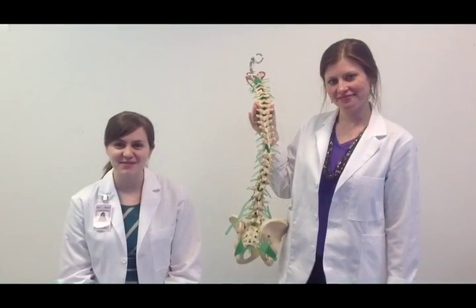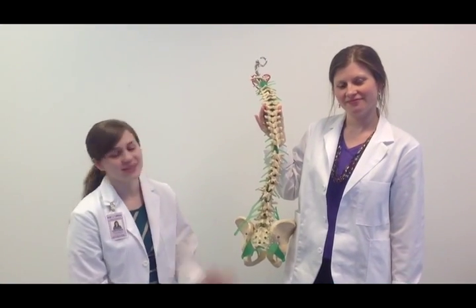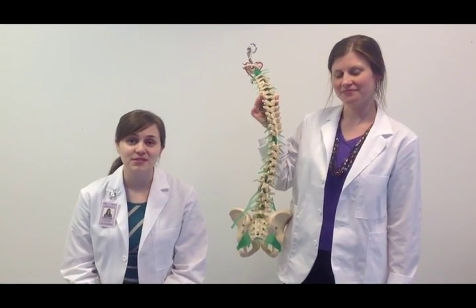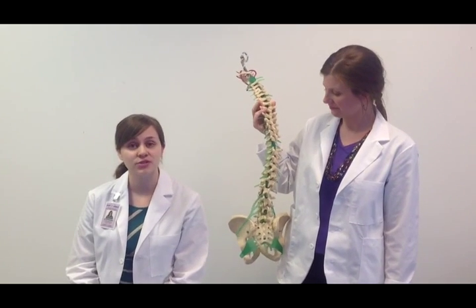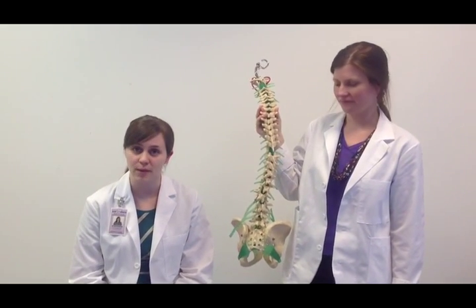My name is Stephanie Fitzsimmons and this is my colleague Wendy Shelley. Today we are going to teach you how to measure lumbar rotation with inclinometry.